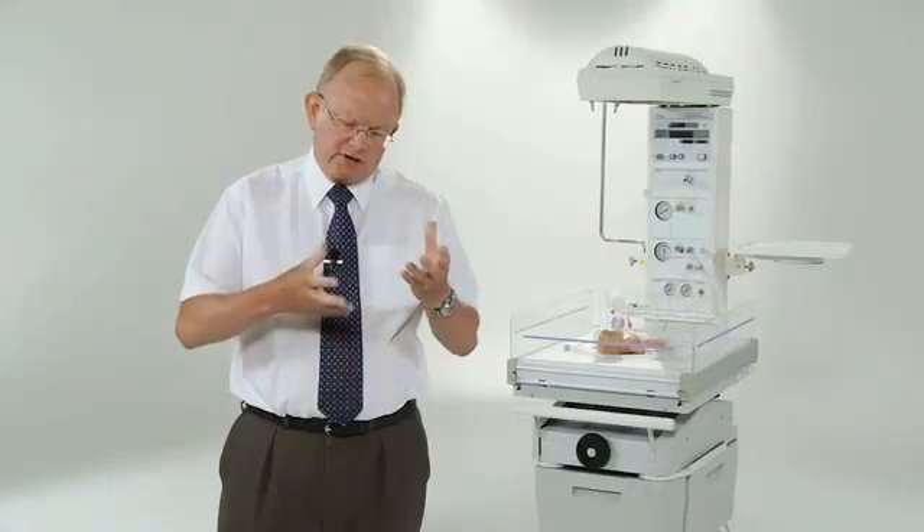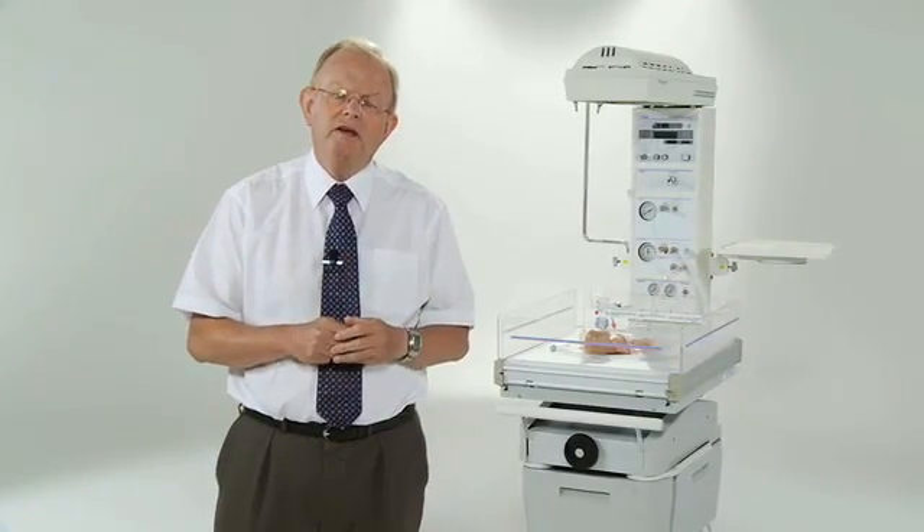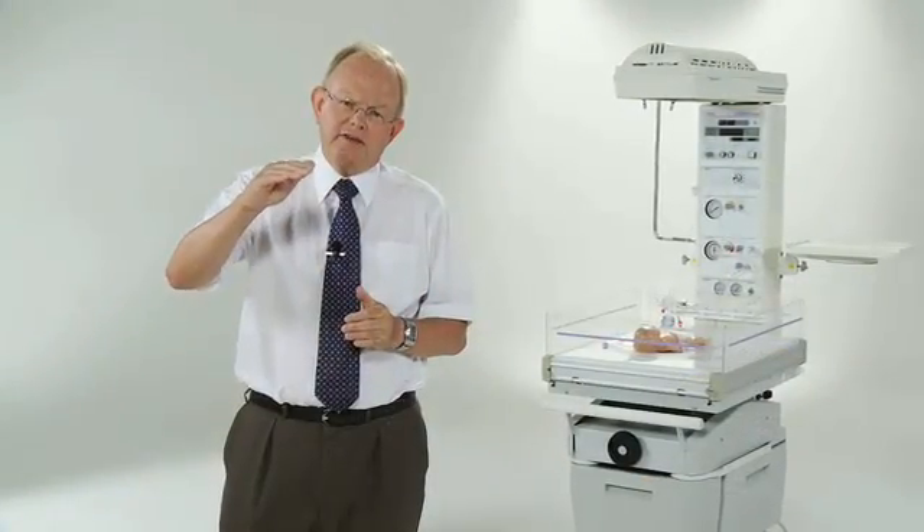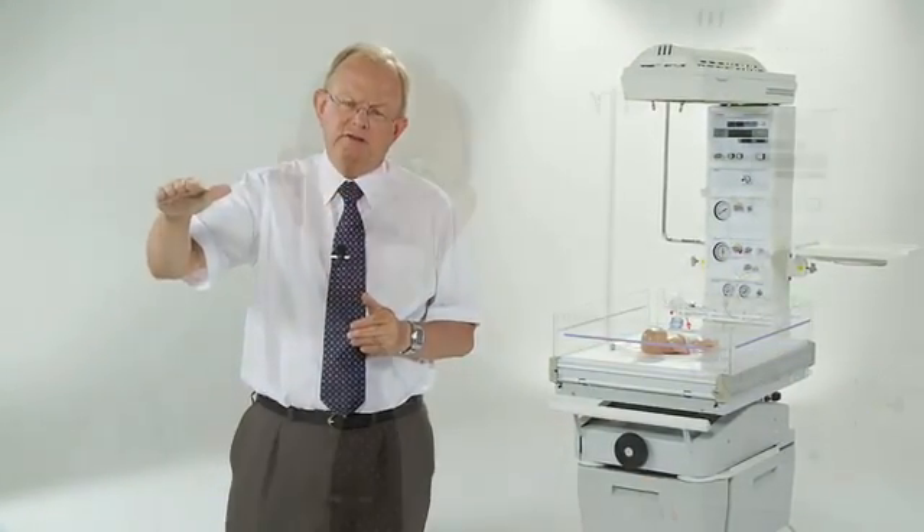As you know, there are three different devices we can use for resuscitating babies. There's the self-inflating bag, there's an anaesthetic bag, and there's the T-Piece. I particularly like the T-Piece resuscitation device because it provides consistent CPAP and PEEP, and the inflating pressure can be fixed.